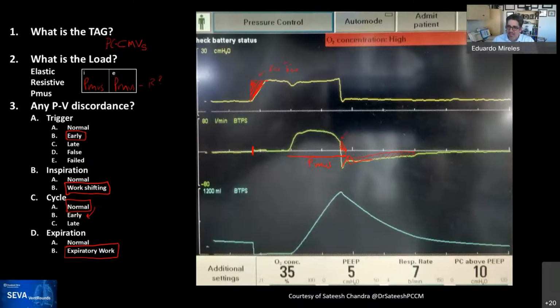Does that make sense, Ahmed? And that's why we move away from reverse trigger as a term, because it's a mechanistic term, and go rather to a descriptive term. It does. Thank you. No problem. Excellent question, and thank you for bringing it up.